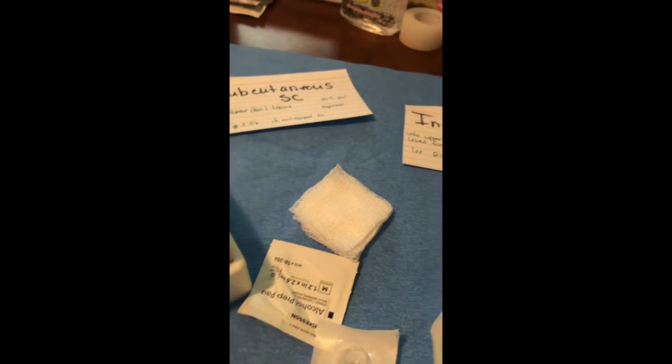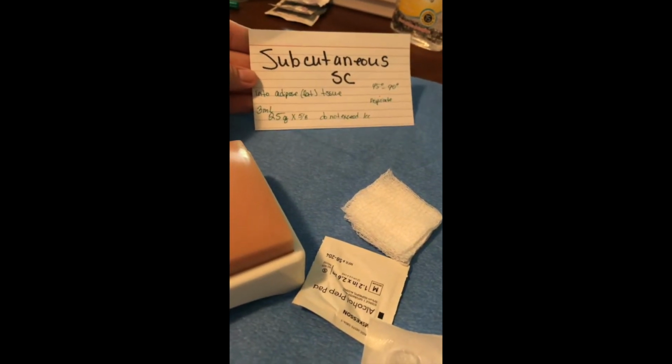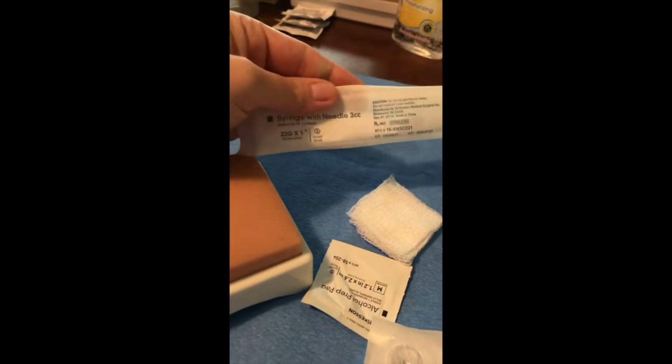But you may see it have to be done at a 90-degree angle depending on the needle size. Subcutaneous injections also means insulin and heparin. Those would be given at 90 degrees because of the needle that you'd use. But we are going to use a 3 ml syringe.